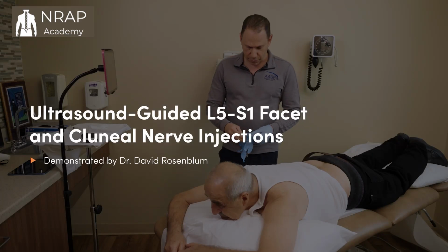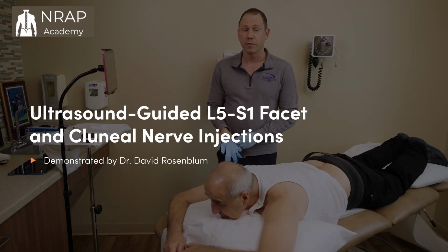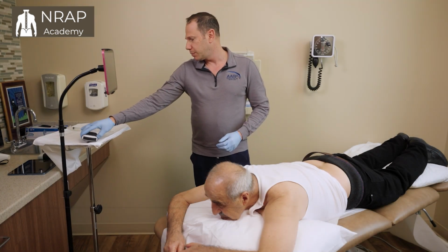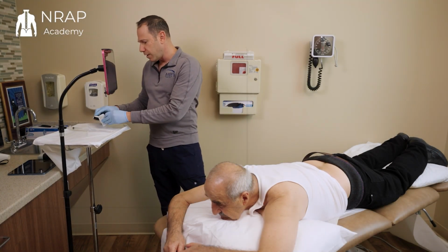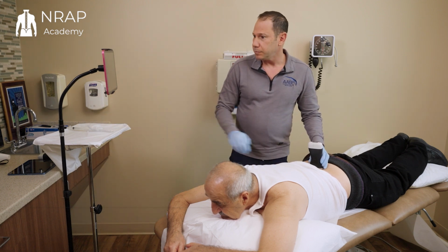So this patient had an epidural steroid injection a little over a week ago. He's overall improved. However, he still has some pain that he localizes to the paravertebral space around the L5-S1 facet joint. So I'm just going to scan.